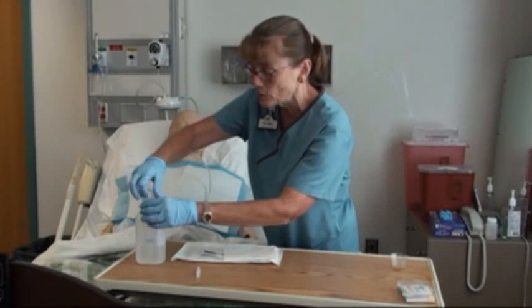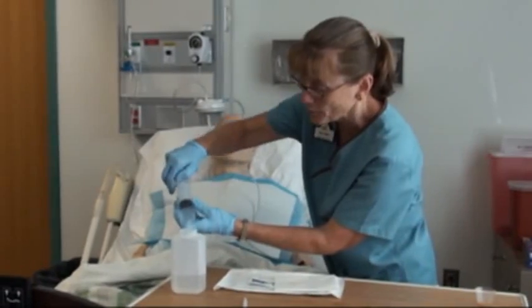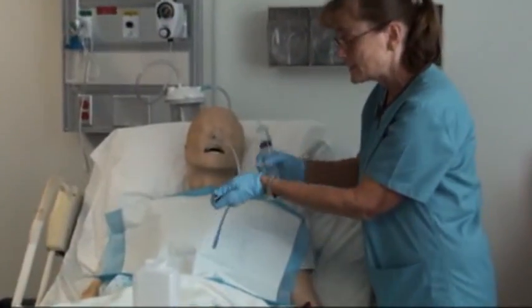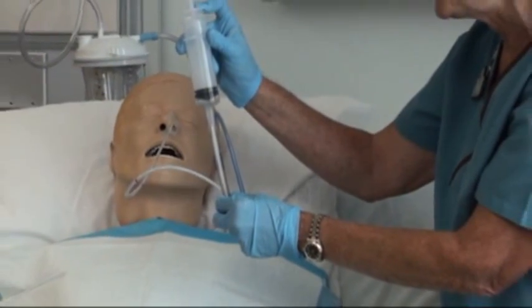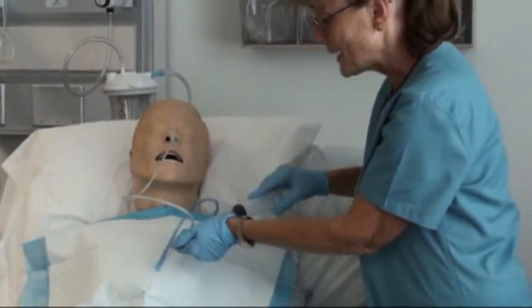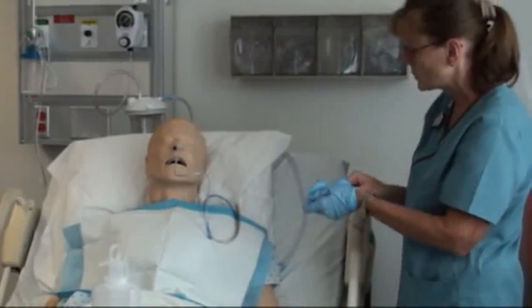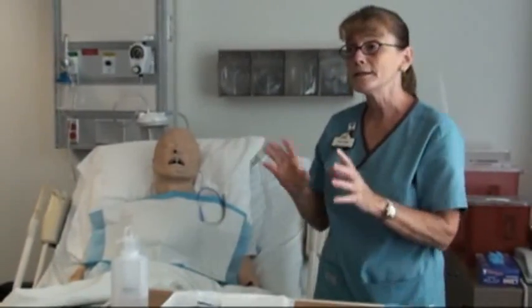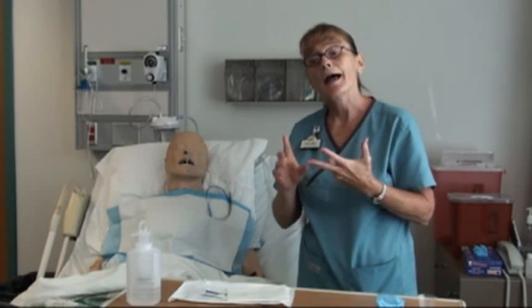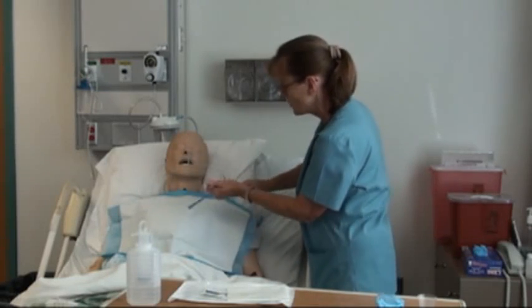Depending on your facility's policy, irrigate with 30 mL of water. Clamp off, remove the plug, insert the syringe — it's now a closed system — and slowly irrigate the tube, then clamp it back off. Once everything looks good, connect to suction. Suction may be continuous or intermittent, low or medium, depending on the doctor's orders. In this case, it's intermittent low suction.